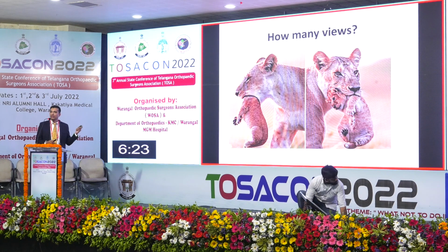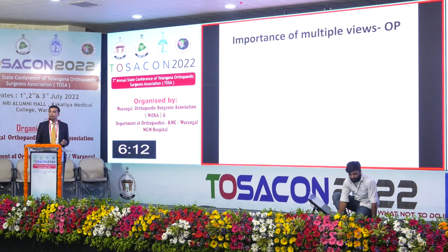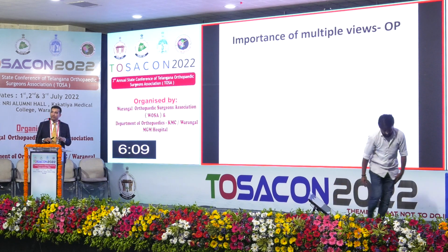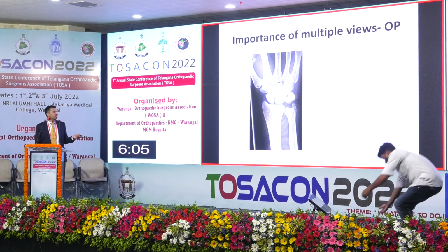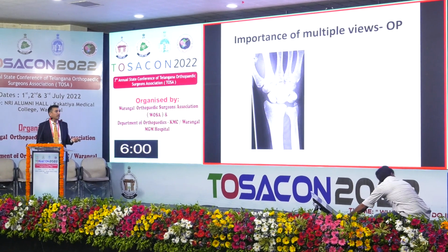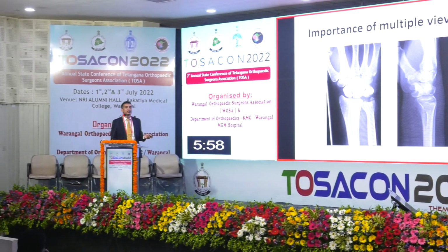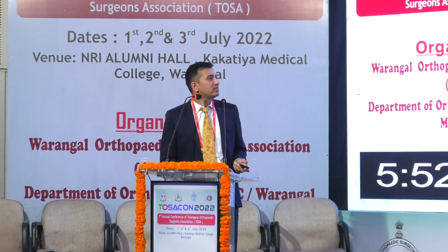This is what we saw in that previous perilunate dislocation which I have seen. So minimum two views, and most of the time multiple views are better to get a proper diagnosis. So the importance of multiple views in the OPD: when the patient comes to us in the OPD, we have seen this. Never send off with one view because you will miss an important diagnosis that the lunate is dislocated. And you can clearly see that the lunate is triangular in shape.